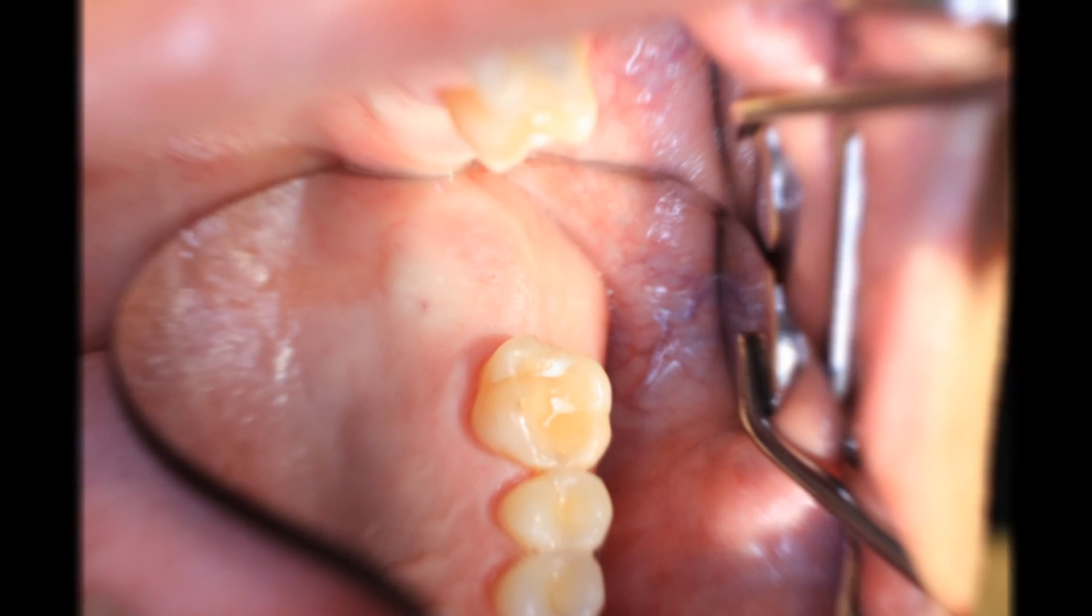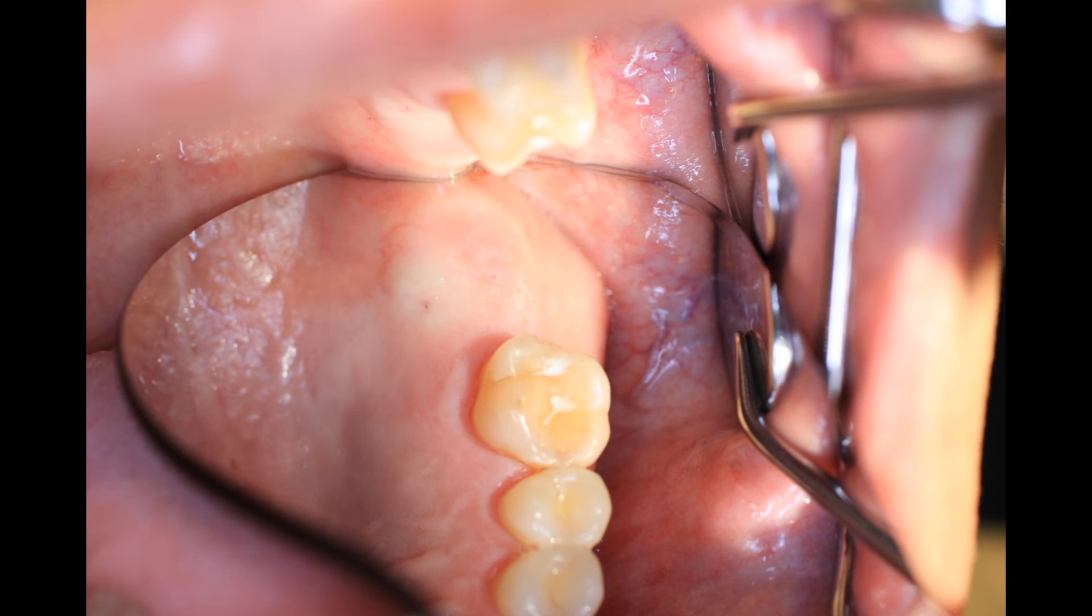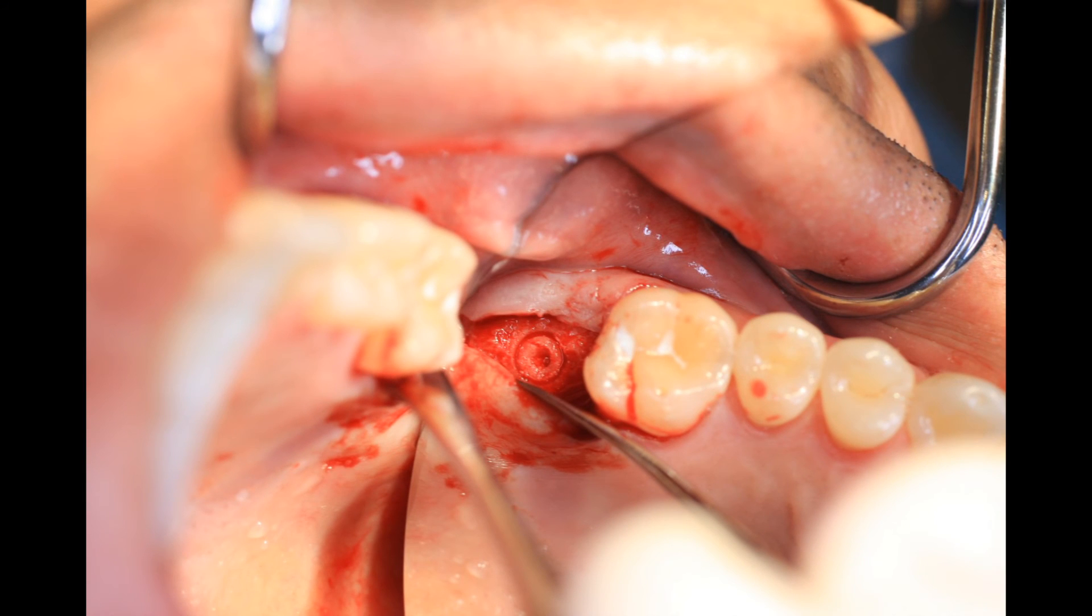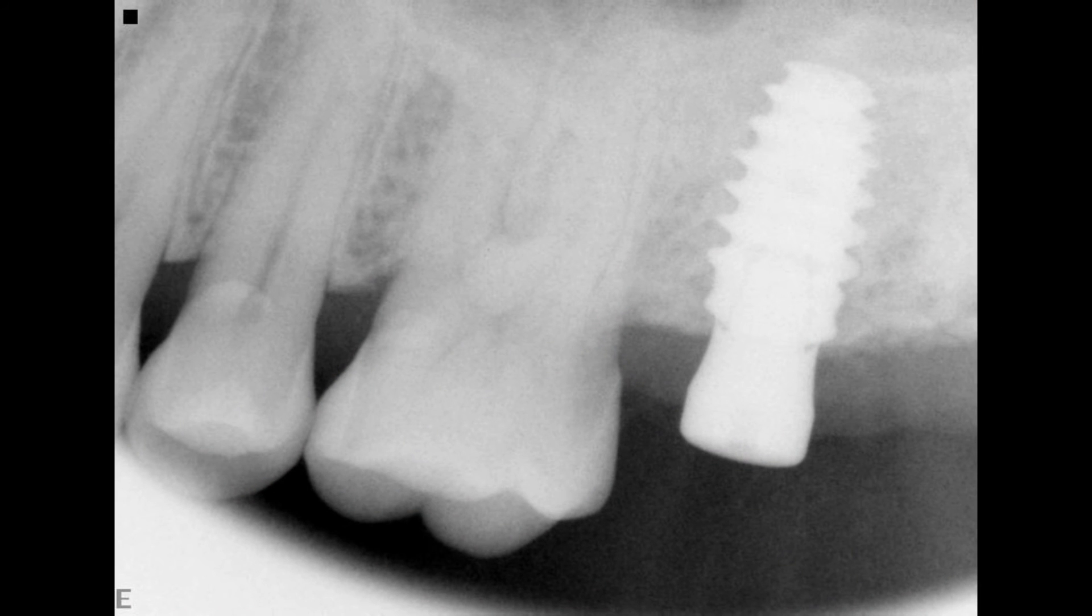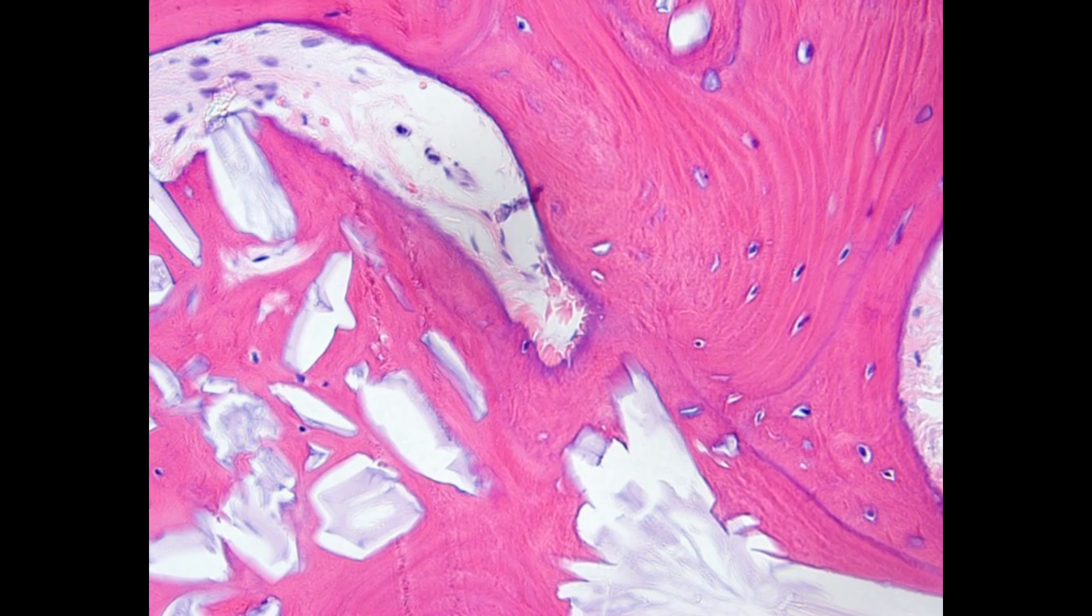The Collagen contains the graft material and provides a scaffold for keratinized tissue to develop over top, while the Osteogen provides a scaffold for host bone formation prior to implant placement. Here is a radiograph of the healed site following placement of the implant. The histology from this implant case shows vital lamellar bone formation as well as some of the larger residual Osteogen crystals that are currently undergoing the resorption process.